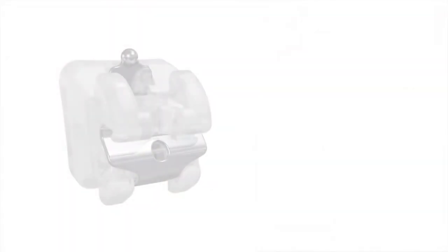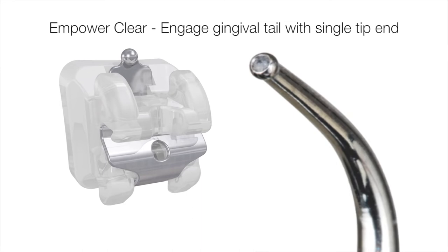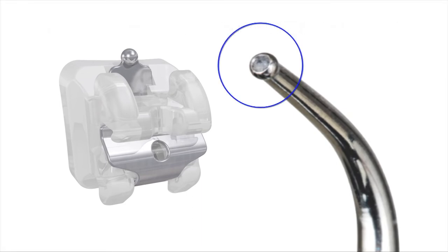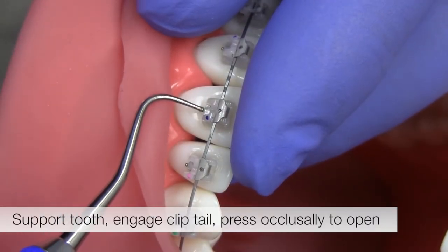The second method for opening Empower clear is to use the single end of the instrument to engage the gingival tail of the clip. A recessed dimple on the tip of the opening instrument engages the ball on the end of the clip. Support the patient's tooth, engage the clip tail, and press occlusally to open the clip.